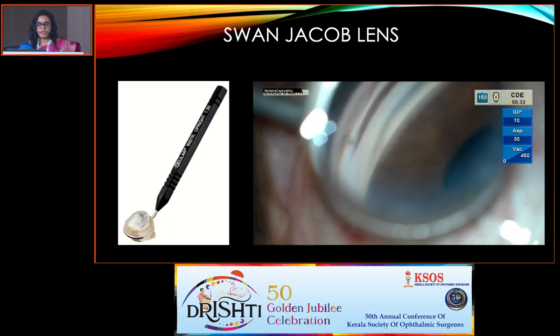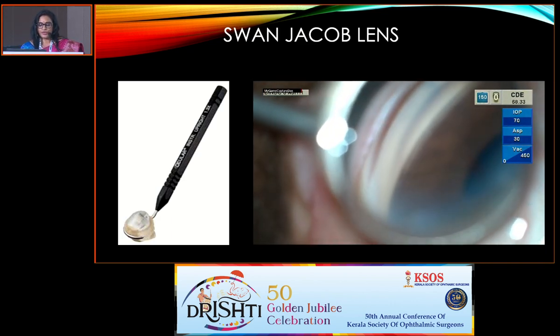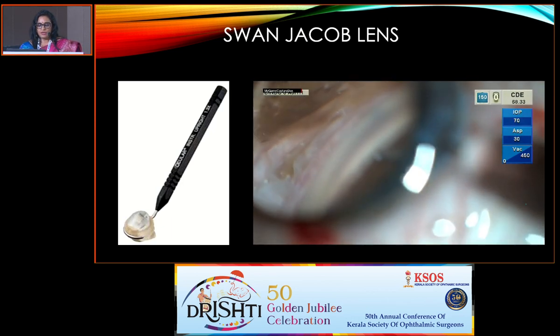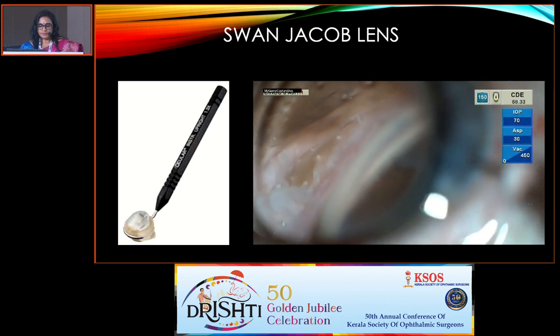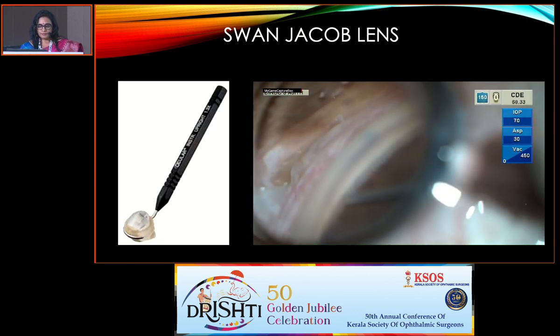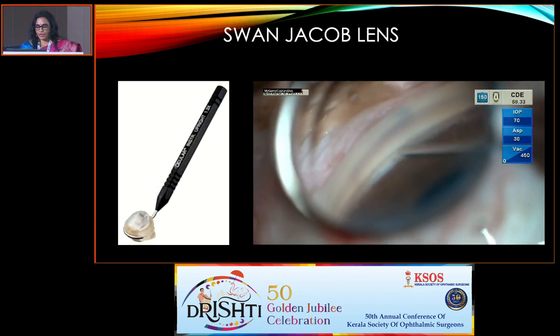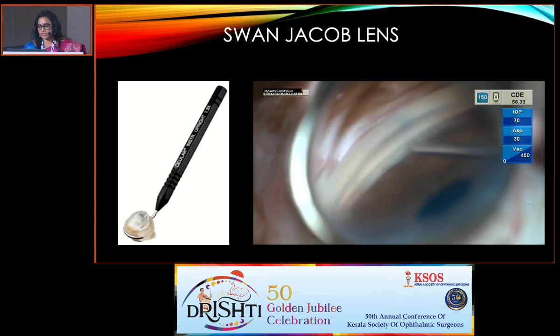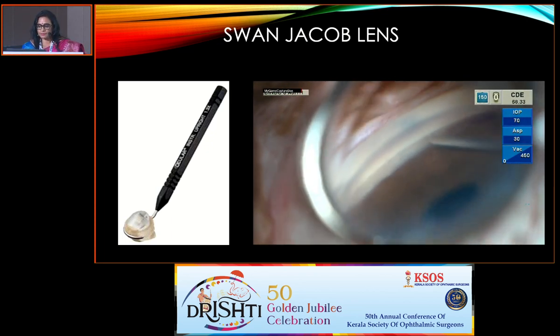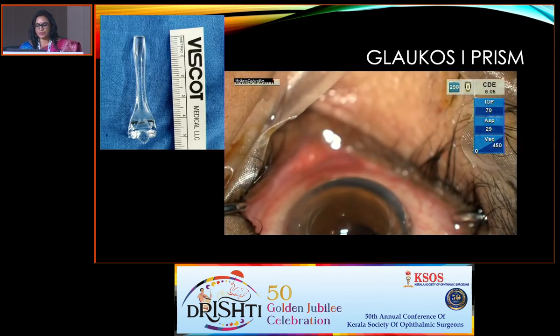And once you get the view, magnify and have an image. Now you can identify all the structures. And then you can start your procedure. This is a bent needle goniotomy being done. So now every cataract surgeon can become a glaucoma surgeon too. But beware, it is only in the early glaucoma cases.